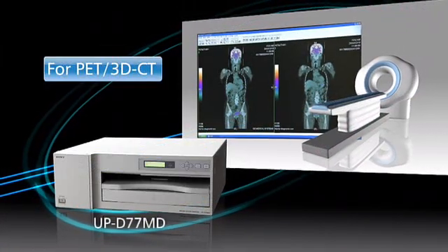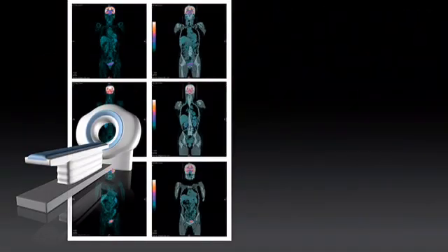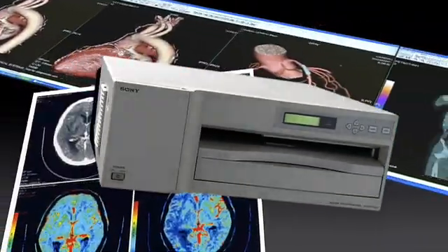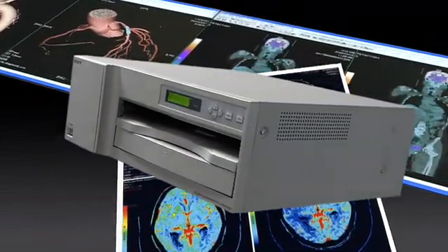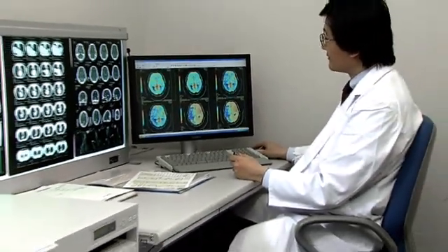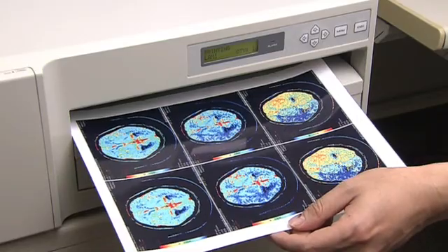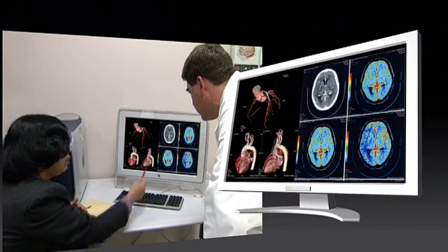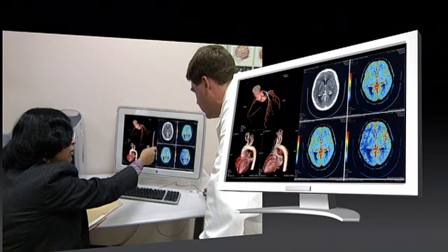For PET and 3DCT, Sony offers the UPD77MD. This color printer prints on A4 and letter size paper and has all the qualities needed in the medical field: high image quality, high speed, and compactness. For nuclear medicine and 3DCT, color images are now more frequently used than ever before. The UPD77MD can provide high quality images thanks to dye sublimation printing technology, and its biggest advantage is that it reproduces the colors you see on a workstation display with supreme accuracy.